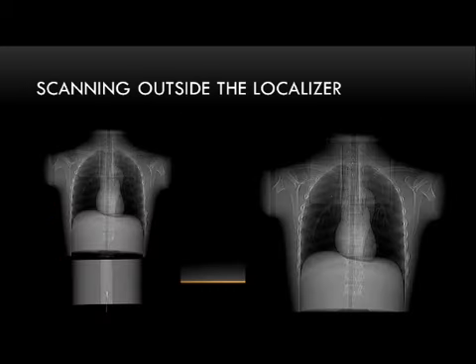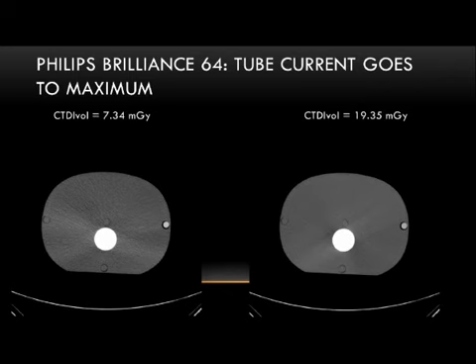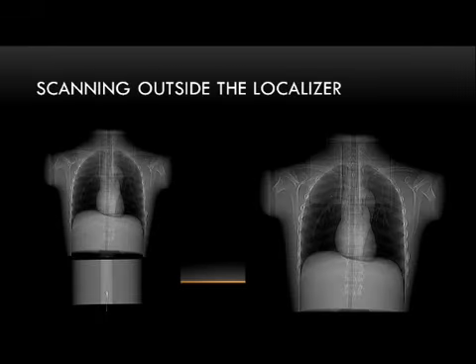And I've got a couple of examples here. This shows a phantom combination, the chest and the abdomen. The whole thing was scanned, and then the localizer was acquired with just the chest and, I guess, the liver too. So this is kind of into the abdomen, but the combination of these two, a full localizer radiograph and a partial one. I did this on a number of different scanners. I did this on a Philips system, and all these images are in this portion here.